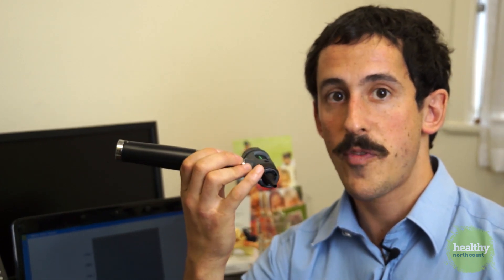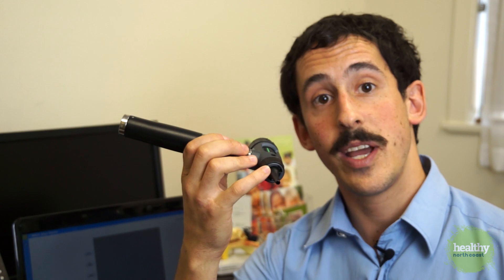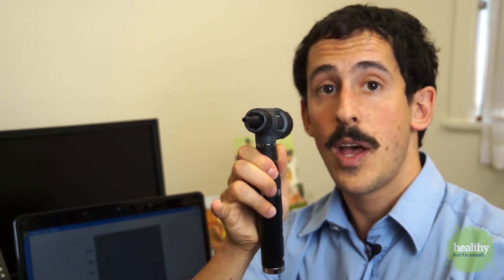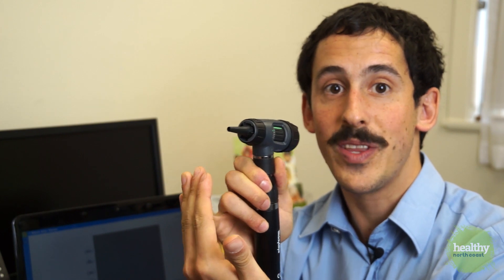Earwax is probably the most common obstacle to getting a clear view of the ear. One of the major differences with a video otoscope is that it has a camera, so you're going to have to hold this piece of equipment a little bit differently than a manual otoscope. We're all used to holding our otoscope with the classic pencil grip, but if you do that you'll get a sideways picture on your screen. For that reason, I personally choose to hold the otoscope in an upright position and anchor it against the patient's face with my pinky, to ensure that you don't poke them and hurt them.